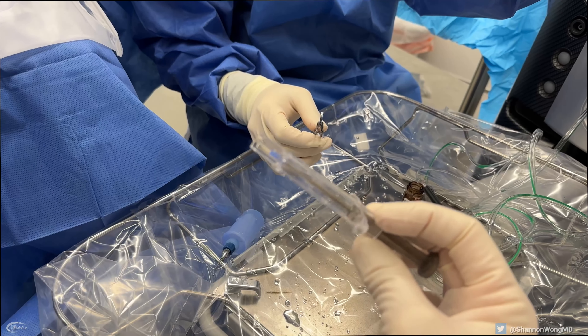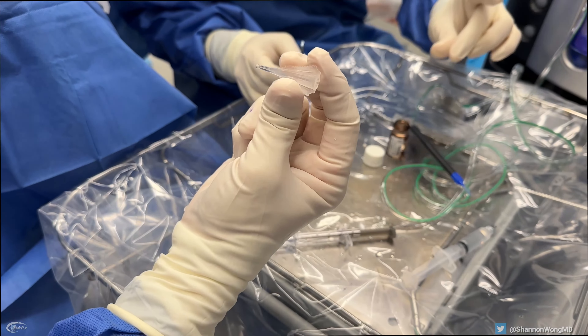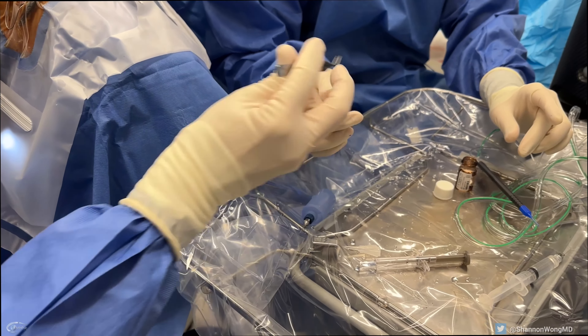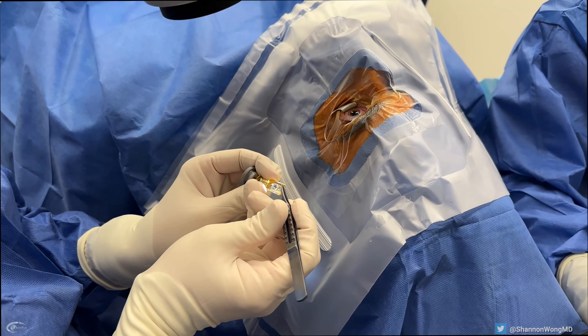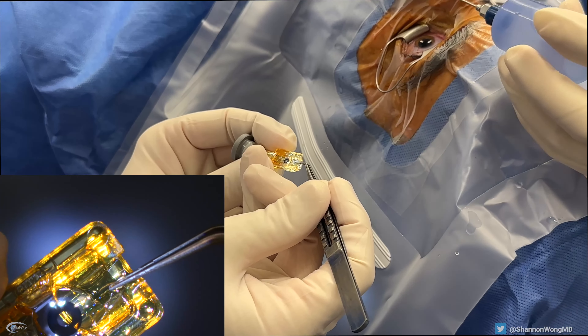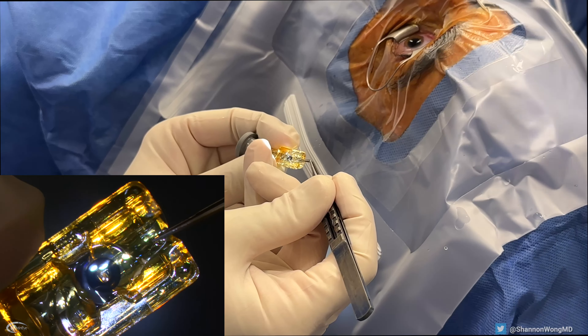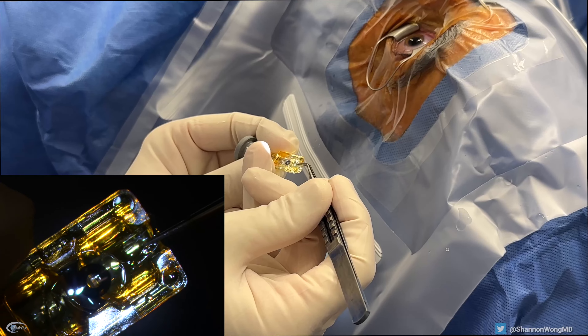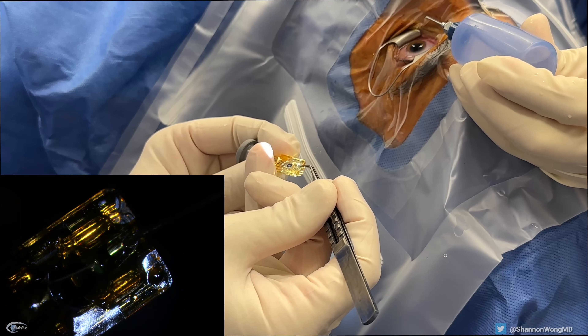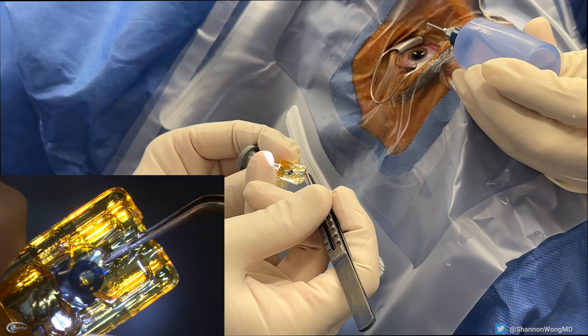We inspect the lens injector and then the lens cartridge. Initially, we tried to remove the lens from the plastic receptacle by pulling on the haptic. The lens optic is tightly secured to the plastic, and we are unable to free the optic from the plastic by pulling on the haptic. Therefore, we use our smooth forceps to liberate the optic from the receptacle by pulling on the peripheral edge of the IC8 optic, which works nicely.